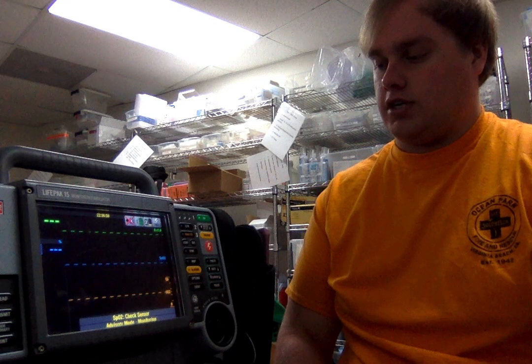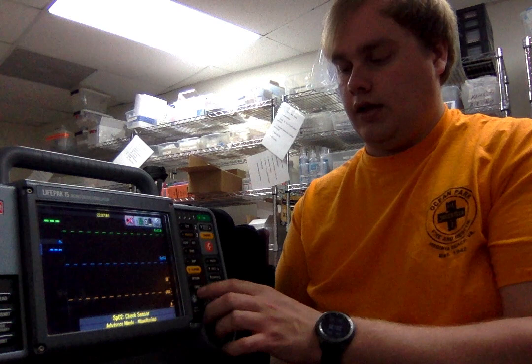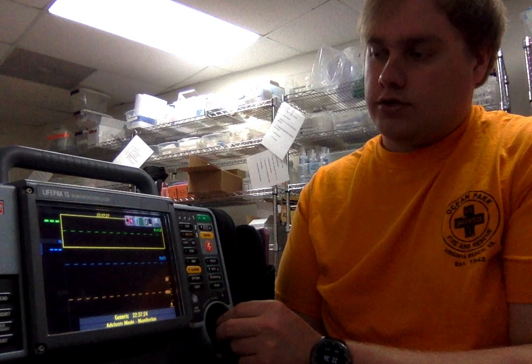This machine not only allows you to take your patient's vitals, defibrillate them, pace them, or synchronized cardiovert them — it also allows you to chart all of the interventions you do, such as giving drugs, doing 12-lead transmission, and IV access. You're able to document it all in here and it'll print out your sheet with time stamped down to the second, to allow you to work a cardiac arrest or just transport a stable patient.